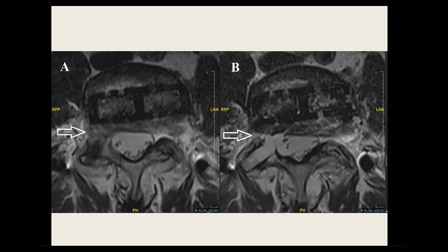I did an MRI 3 months after his surgery, and you can see I used this channel here through the right L4-5 foramen and how I violated the dura here. Now, this sealed up on its own. Patient didn't have any headaches or any residual symptoms.